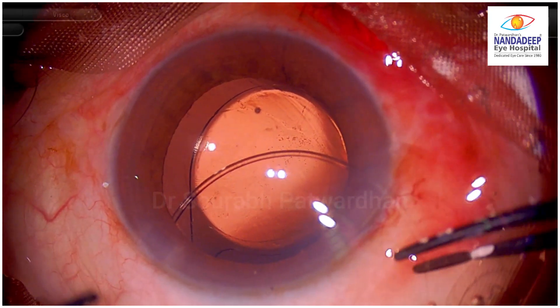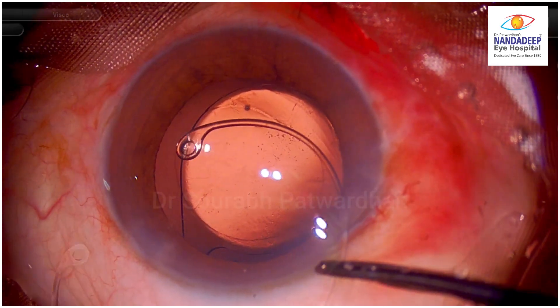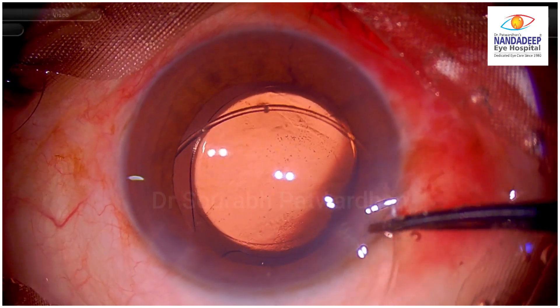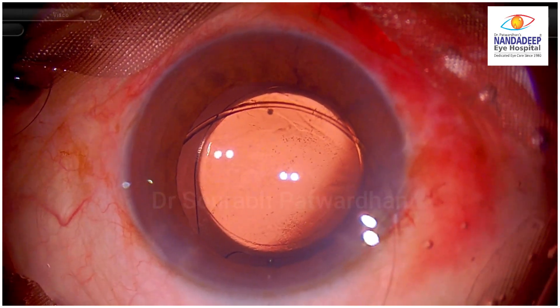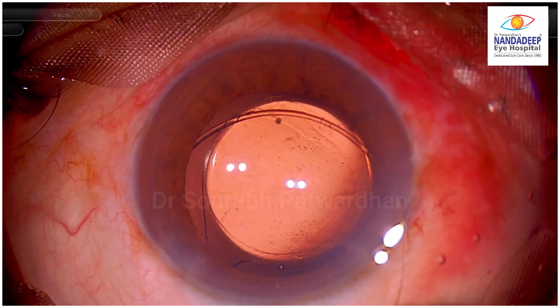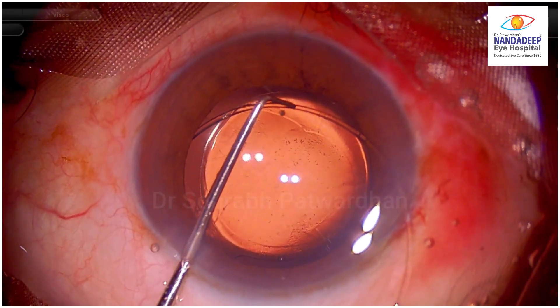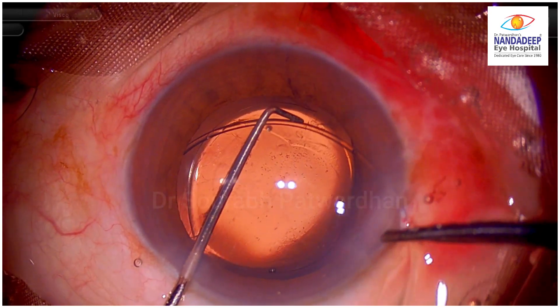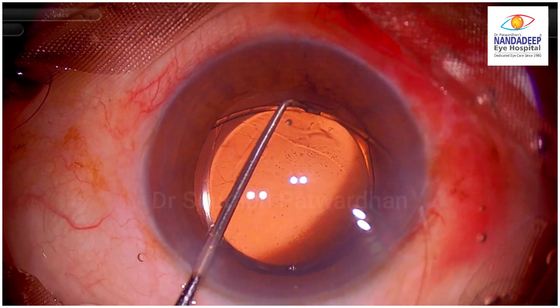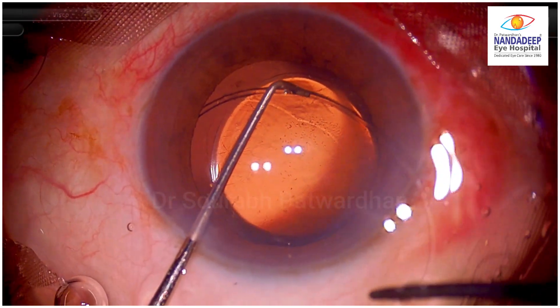Now watch how I insert it into the bag. First, a little bit of vertical pulling of the CTR so the eyelet which is inside goes into the bag. After that, try to push in the CTR carefully. I would like to use a longer Sinski dialer to make sure that the CTR is well directed. Watch how the Sinski is being used here — it is guiding the CTR into the bag, pulling the CTR towards the center a bit so that the CTR is guided right into the bag.